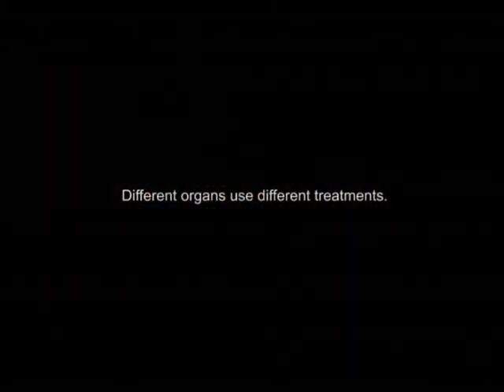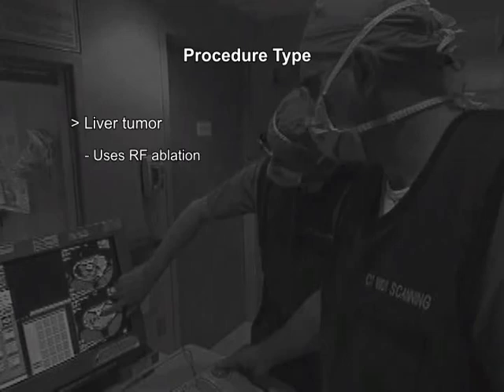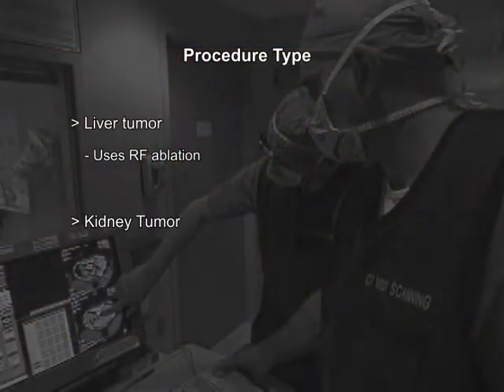How effective are these procedures? Both these procedures are extremely efficient in killing tumors. The differences lie in which organ you're trying to ablate. For example, if a liver tumor needs to be ablated, the preference usually is for RF ablation. This is based on the fact that we have more literature in the liver for RF ablation. On the other hand, if we are burning a tumor in the kidney, we would use cryoablation.